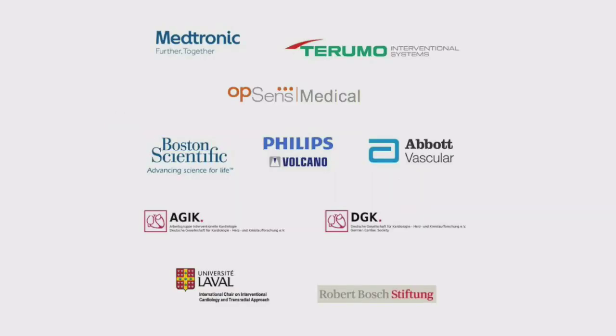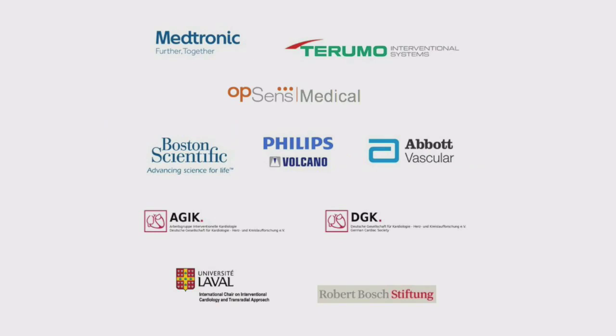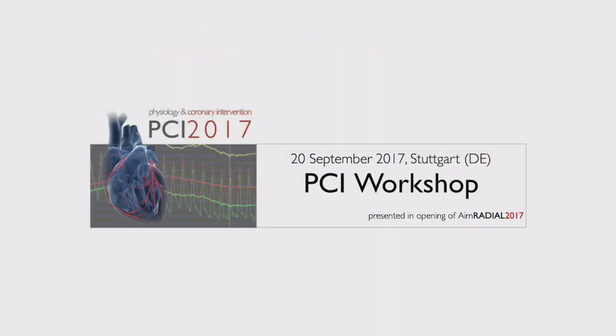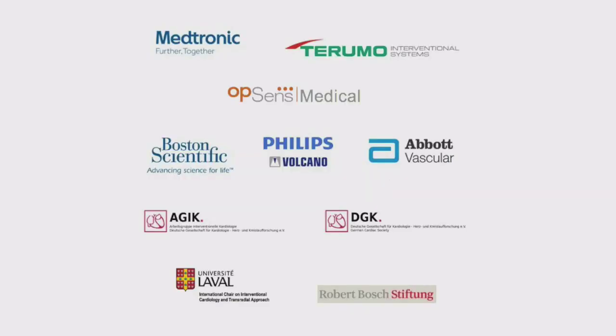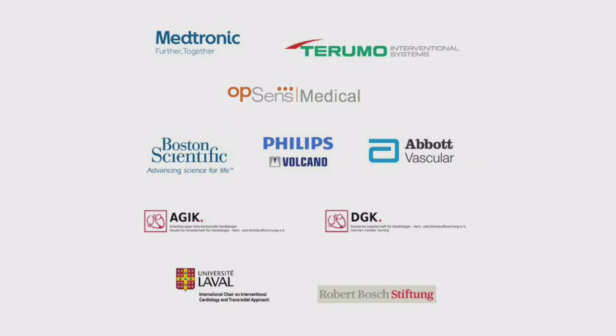You know, we have to remember, and that's something we have been trying to go beyond with this kind of course, that you work under the umbrella of Nico Pijls and Bernard De Bruyne, and I have discussed many times with them, and I believe it's quite fascinating that those guys, let's call them the gurus of the FFR, spend 20 years and more of their life to tell us that when you have a lesion prior to an intervention, you include the diffuseness of the disease anyway, you have the lesion, and finally they came out with, first of all, an ischemic threshold of 0.75 that moved by guidelines to 0.80 without any more objective evidence.